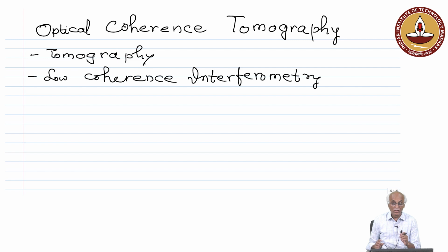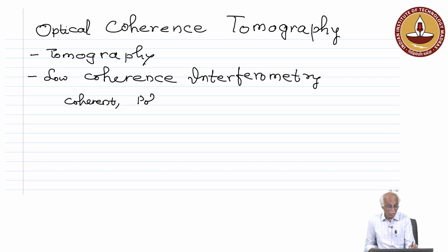So, now what is used as a light source to capture this information? Why do we need a laser? Okay, you are telling it should be coherent. Then we can control polarization to a certain extent.